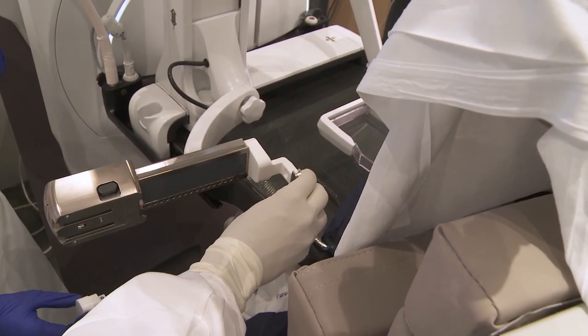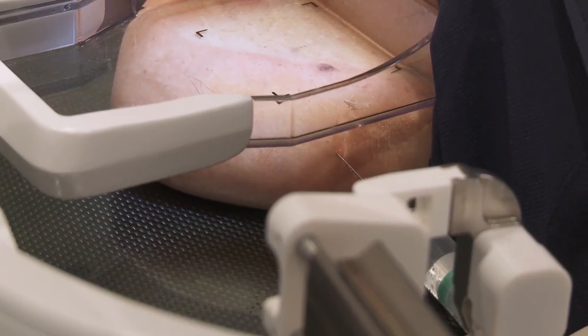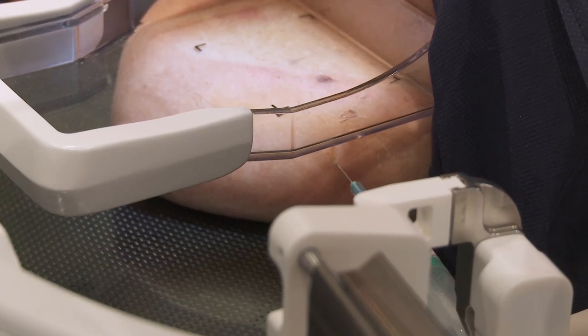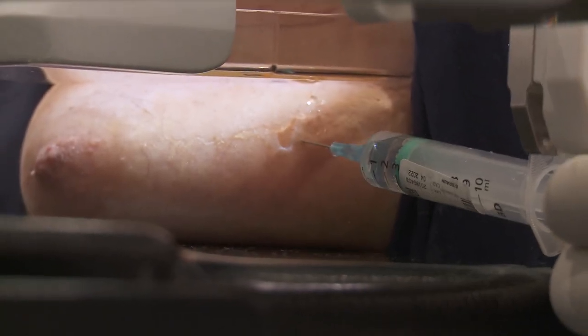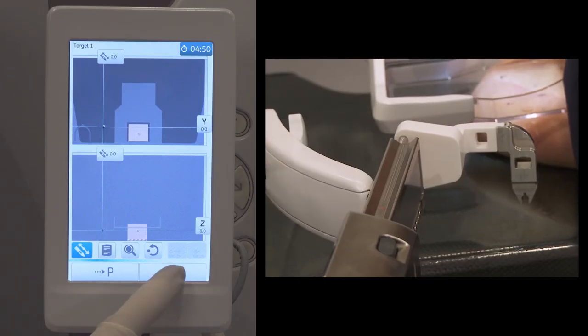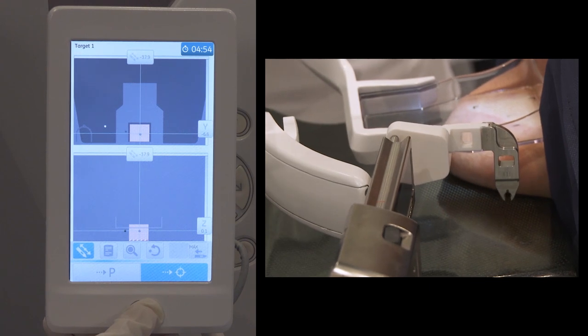Insert the needle guide support. Insert the laser to mark the precise skin incision location. Inject superficial anesthesia to be followed by deep anesthesia. Touch the target button to come back to target coordinates.